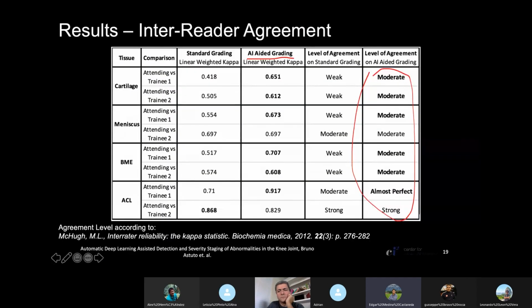He asked, I don't know if you have tried this situation, but I'm wondering how good is the generalization when trying out, let's say, input images from different hospitals or MRI machines. I mean, keeping the same semantic, the knee joint.